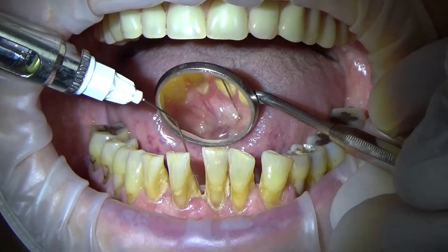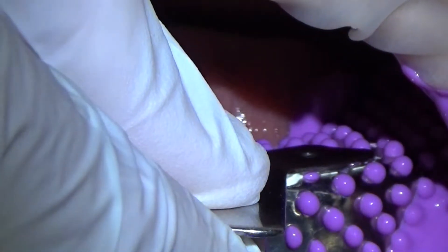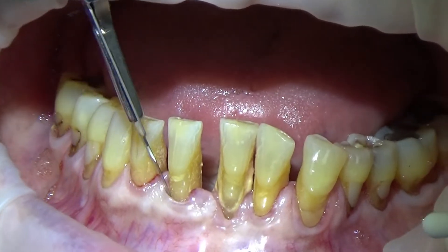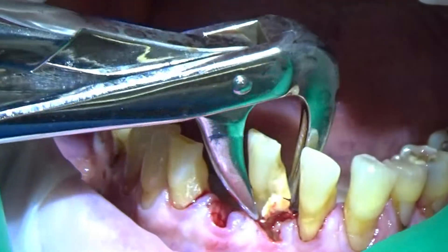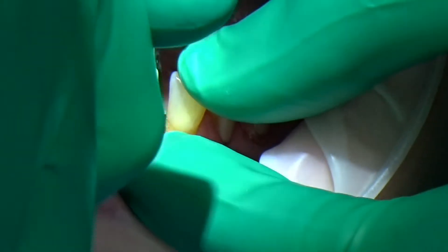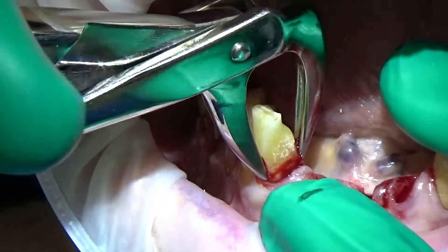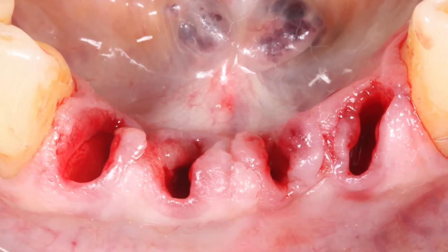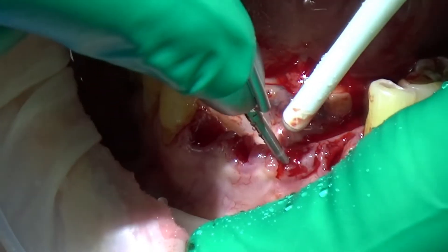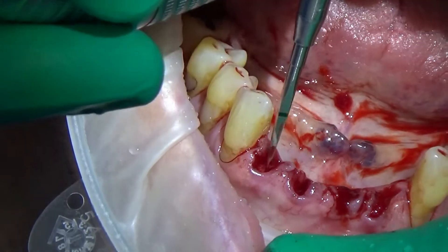In this case we're going to place an immediate implant bridge. Just going around with the 15c to detach that tissue from the roots, then using a rotating movement with some fine forceps to remove the tooth. The main thing we're trying to achieve is not to destroy the soft tissue. We want to get rid of all the granulation tissue and any abscess or infection before we do the implants.